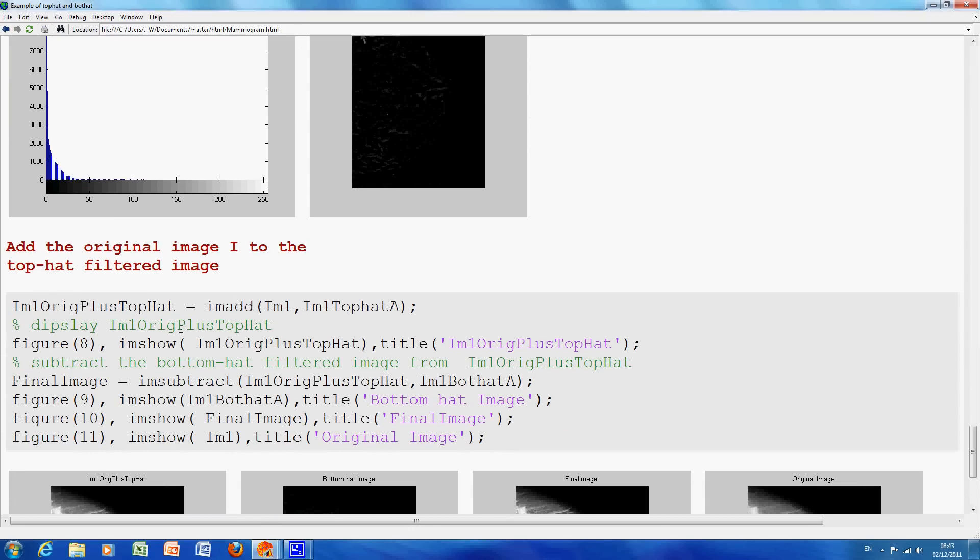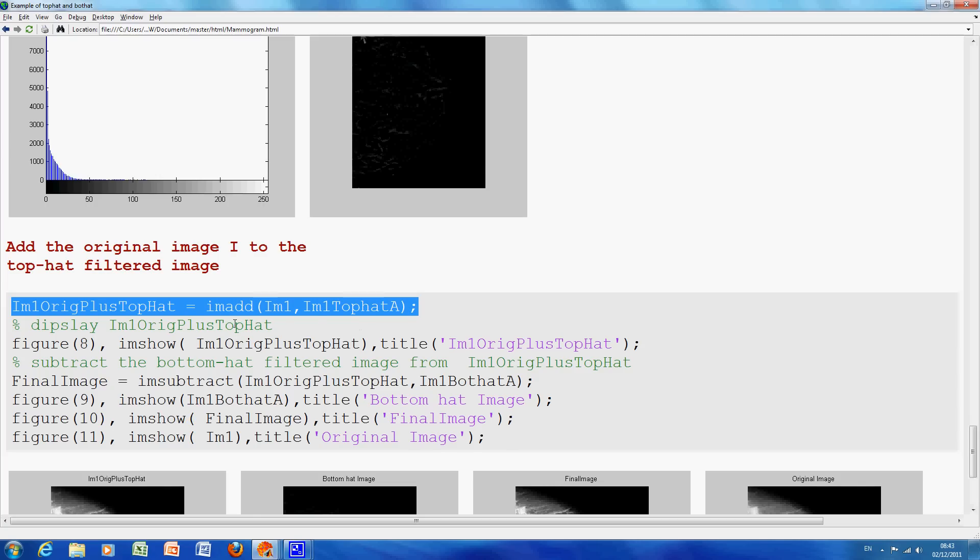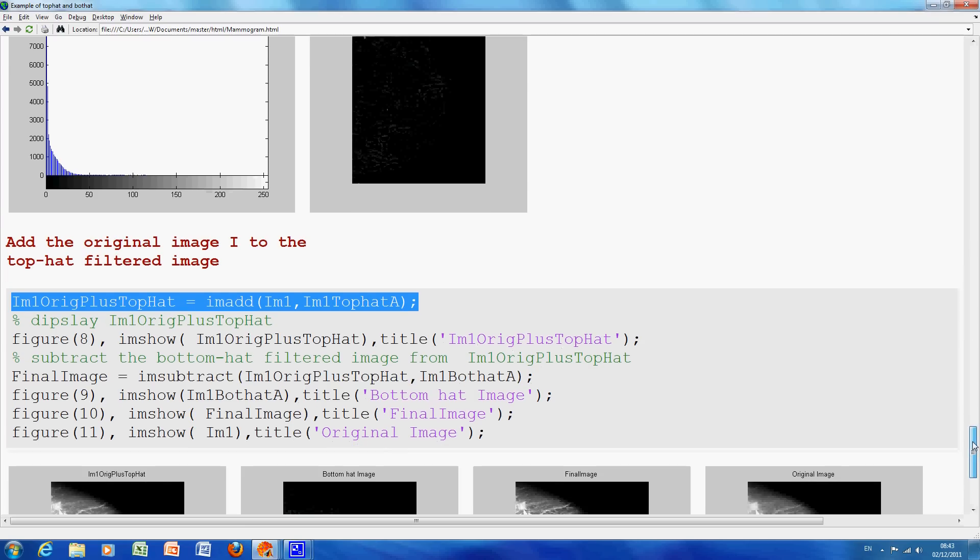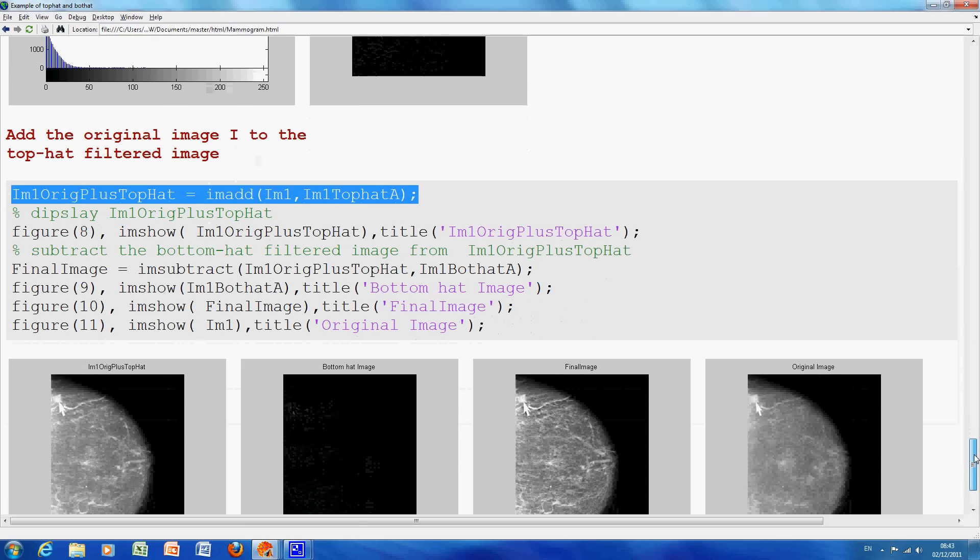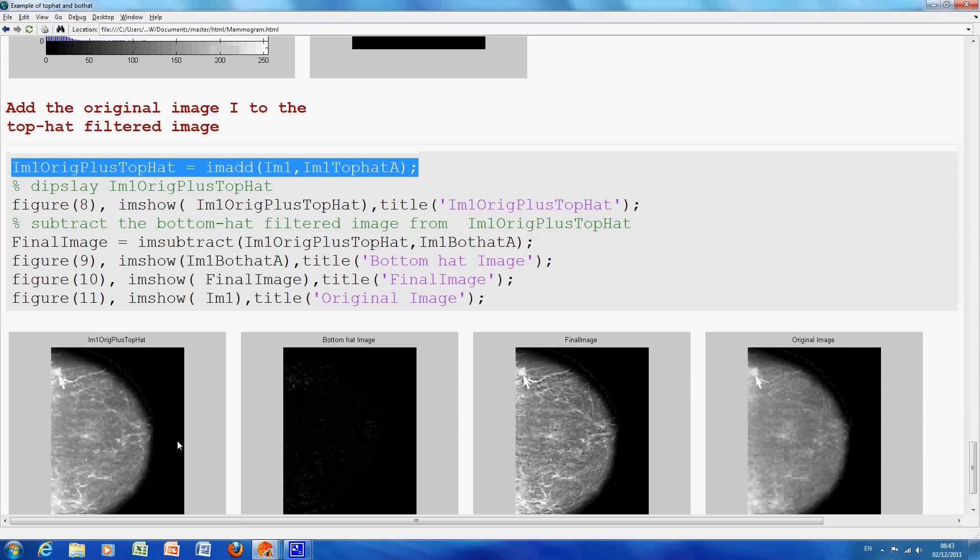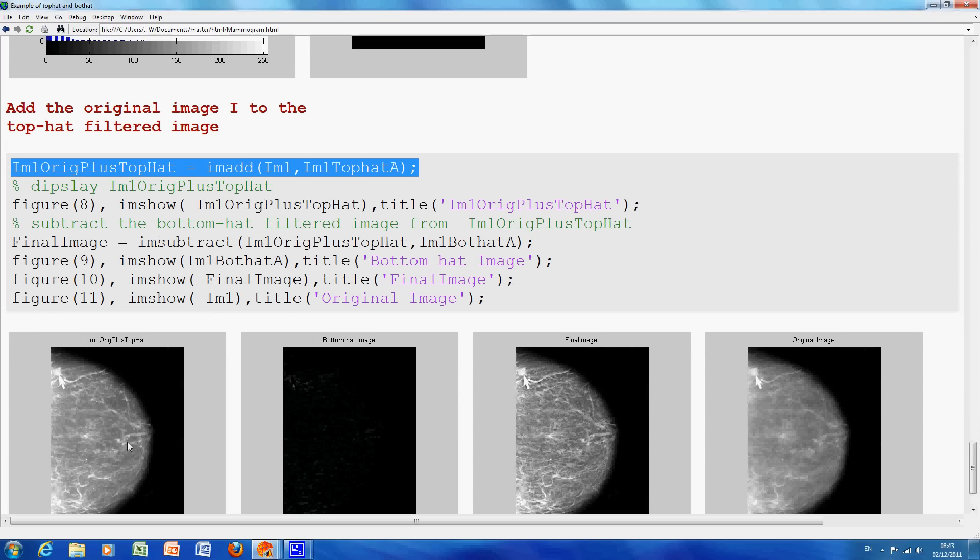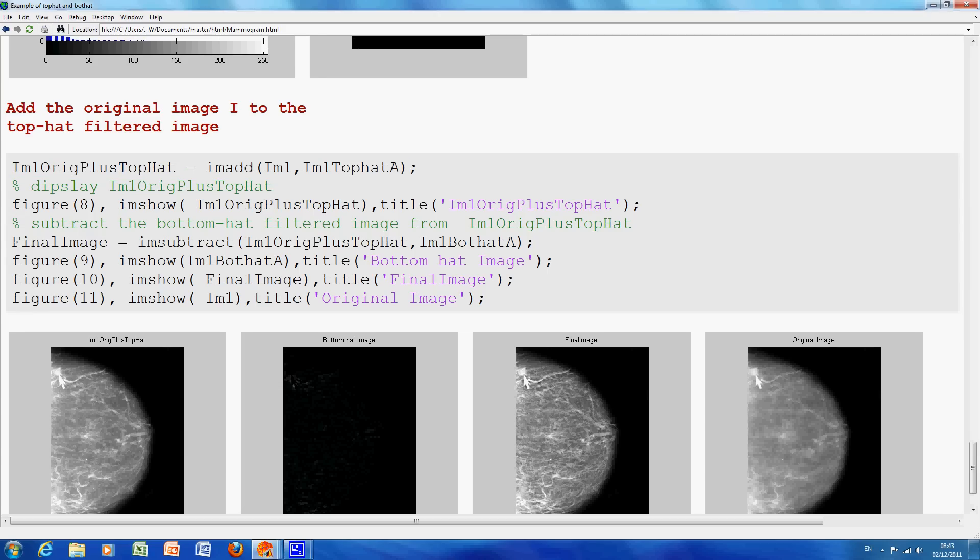Now, this is where the stuff starts. We say, we add to the original, we add the TopHatA, so we're adding the values, so we're adding the white bits, so that'll make them whiter. So, we found the intensity peaks, and we're adding them to the original. So, you would imagine, that image there, the first on the left, so you've added the white bits, now you've done nothing about the dark bits. So that's figure eight.